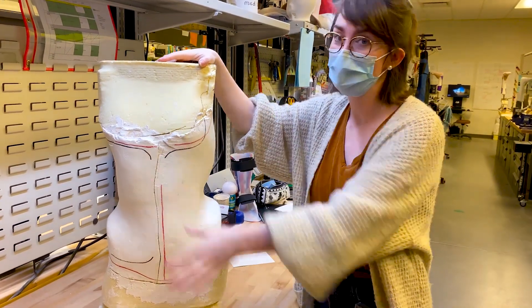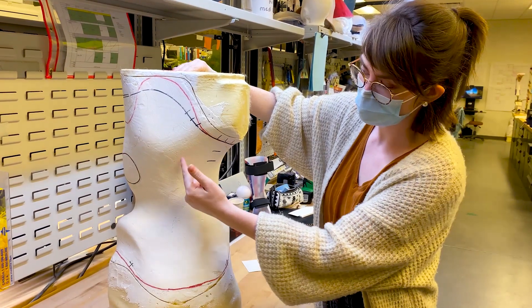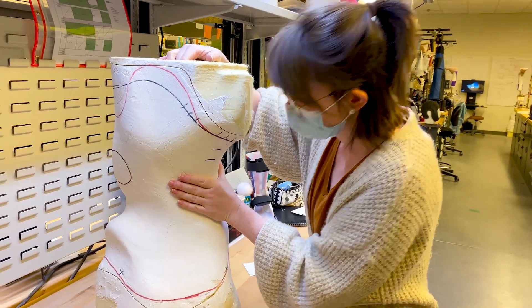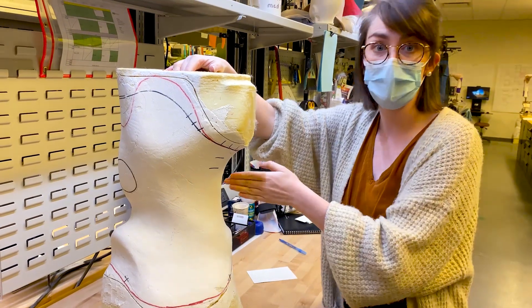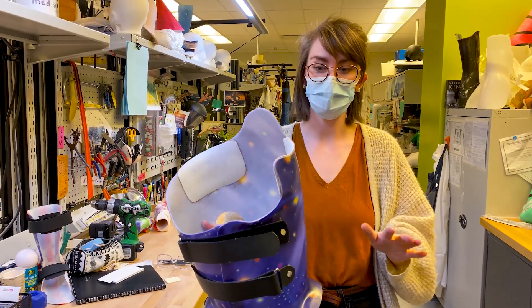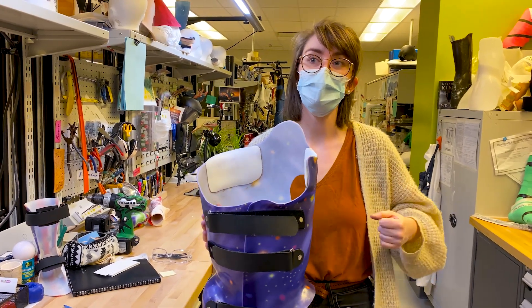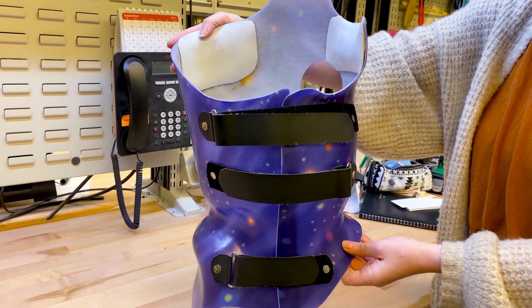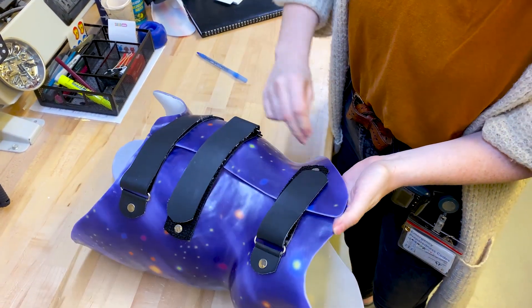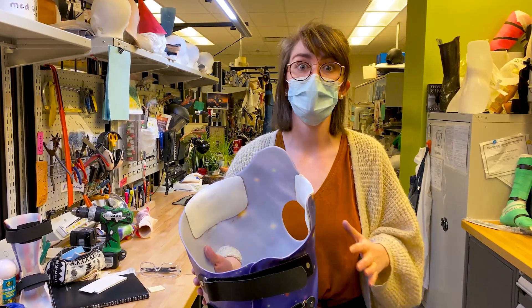This is the front of the model but we're going to look mostly at the back. This person has a curvature that goes like this, and in order to correct it when wearing the brace you need to apply pressure from behind and from the side. This is a finished spinal orthosis for a different person but with a lot of similarities — it opens in the front with straps across. We ask people to do it up really tight because it's a corrective device. It covers pretty much their entire torso and they need to wear it up to 20 hours a day, sometimes more. We do try our very best to make it as comfortable as possible.